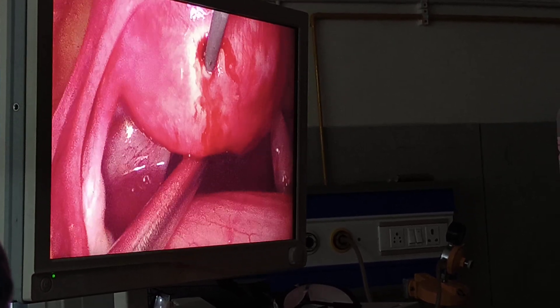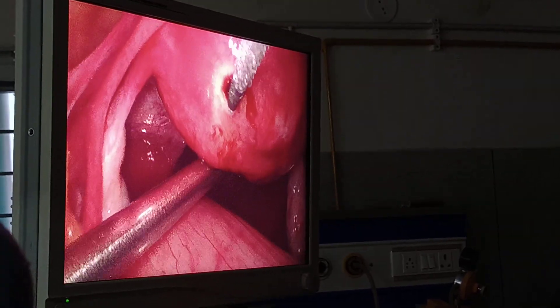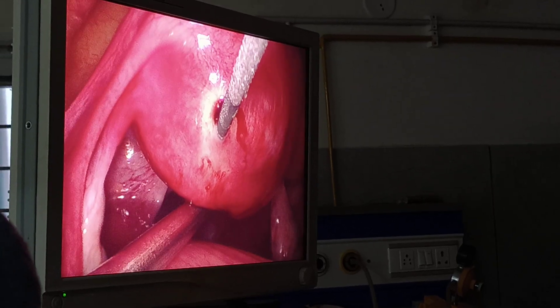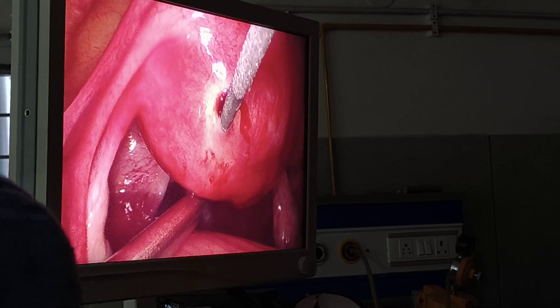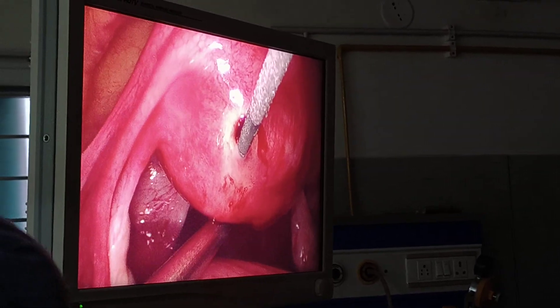So you have to do again. Ablation should stop the bleeding — only water should come. If not controlled, then use bipolar. If not controlled, take another puncture above.